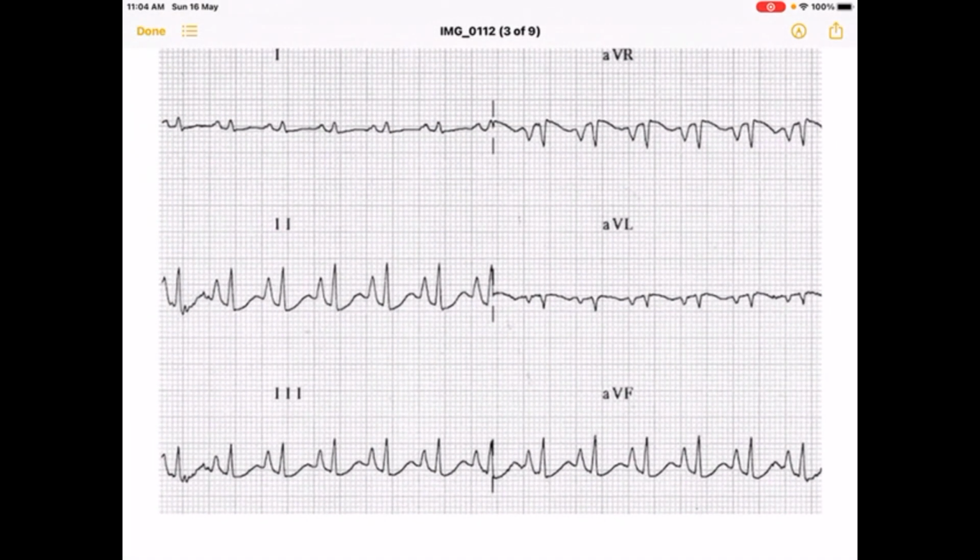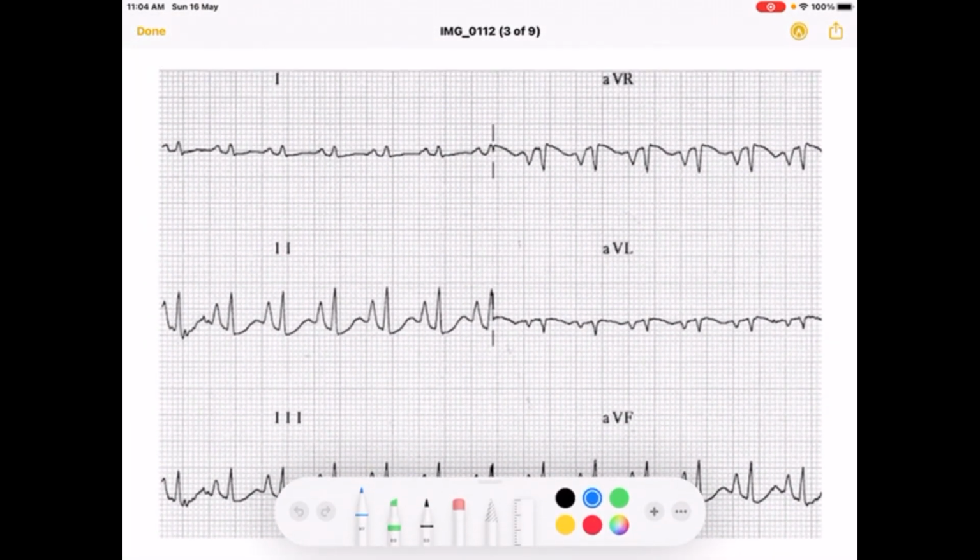In this ECG, you can see the P wave contour is enlarged. The length is more, whereas the width is within 2.5, almost 1.5 to 2. When you count the length, it is 1, 2, 3.5. So the length is more than 2.5 small squares. So this is an ECG of right atrial hypertrophy.